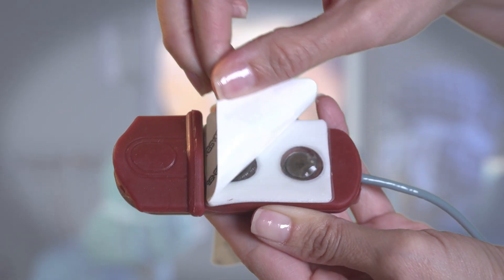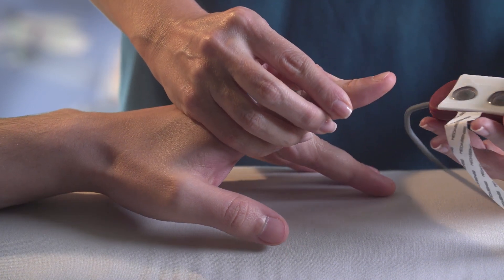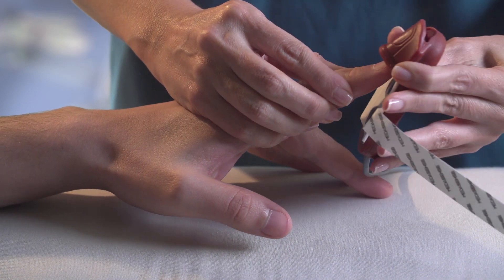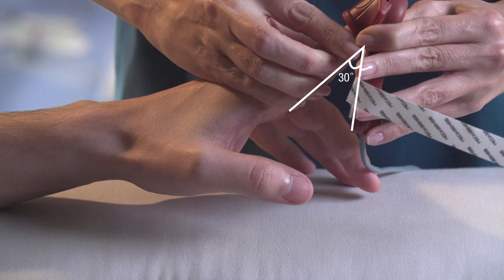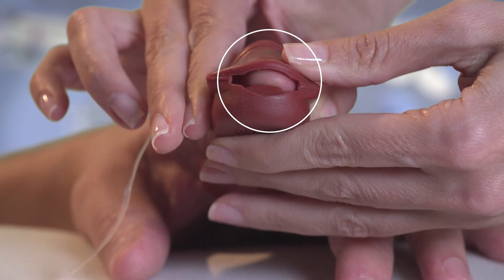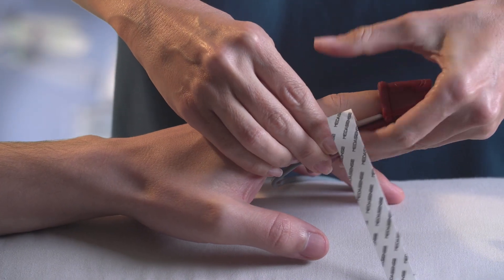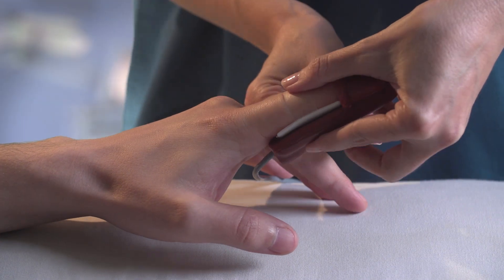Peel off the liner. Choose the patient's finger most suitable in width and length. Do not use deformed fingers. Insert the patient's finger at a 30-degree angle, making sure the fingertip touches the nub at the end of the probe. Attach the sides of the sensor pad to the sides of the finger and wrap the adhesive strap not too tight.